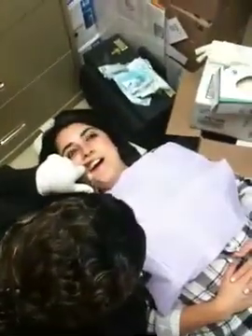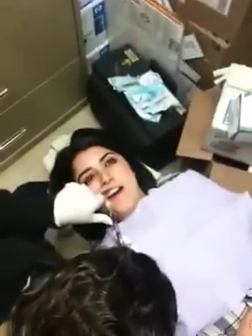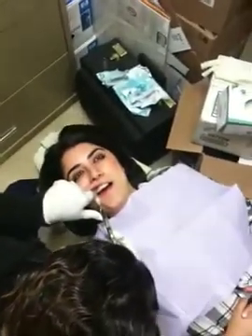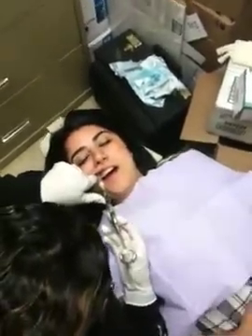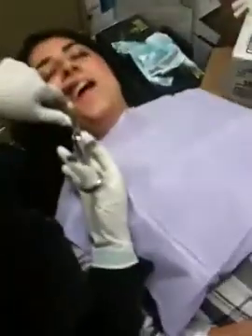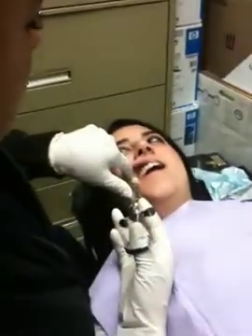You're using her shoulder for your fulcrum, right? You can. You have to — you don't have a choice. So why are these fingers here? You have to have stability. You have to. There's no other way to give an injection without the shoulder.